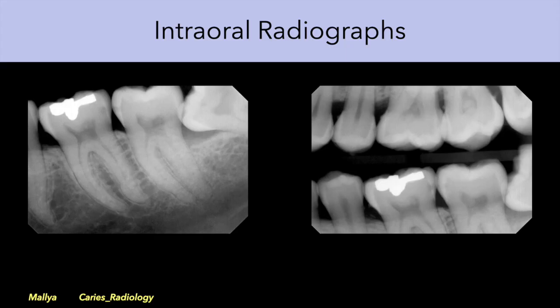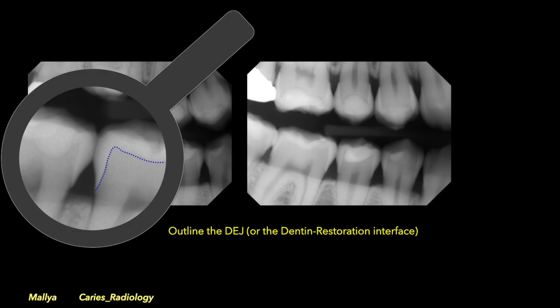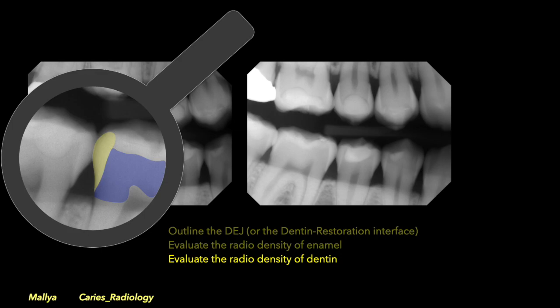Let's start to make these radiological assessments — remember to evaluate both the periapical and bitewing radiographs. When performing the radiological analysis, it's good to have a systematic approach. Remember to evaluate each interproximal surface and each occlusal surface individually. Follow a stepwise approach: outline the dento-enamel junction; evaluate the radio density of enamel, which should be continuous, uniformly radiodense, and more radiopaque than dentin; evaluate the radiodensity of dentin; and look for areas of radiolucency especially immediately below the DEJ. Remember that the tooth surface may be imaged on more than one radiograph, so confirm your findings on multiple images.